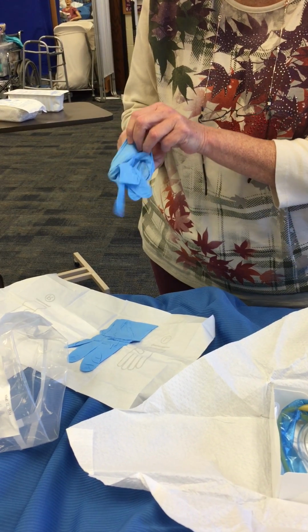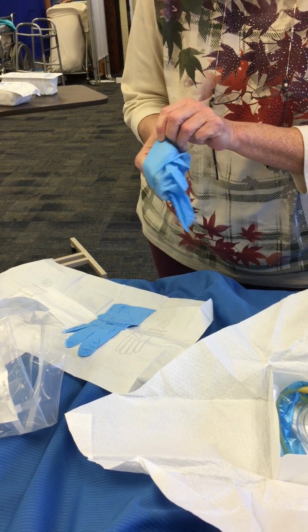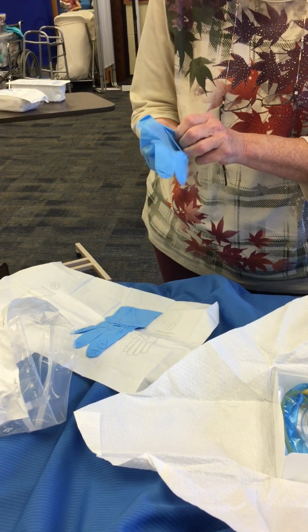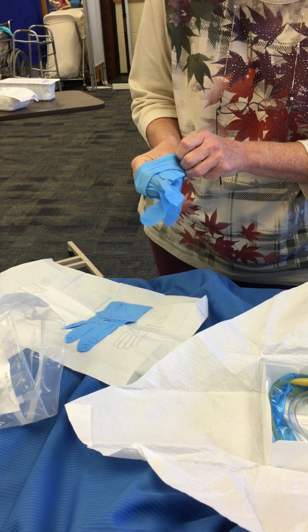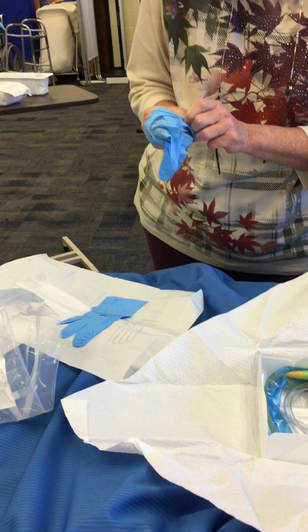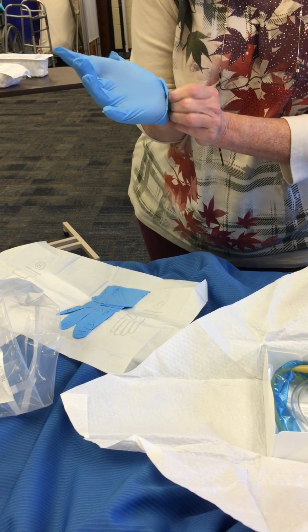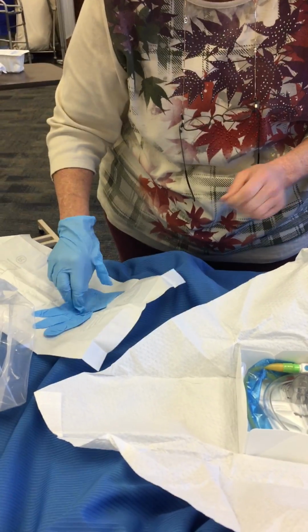Pinch the first one. Never did get my thumb in there.